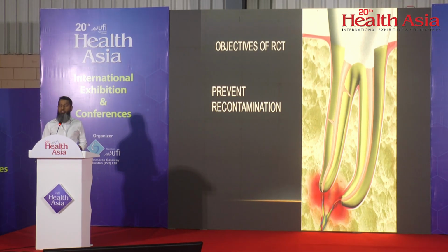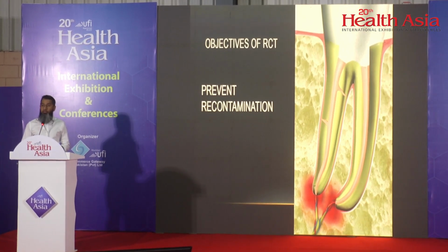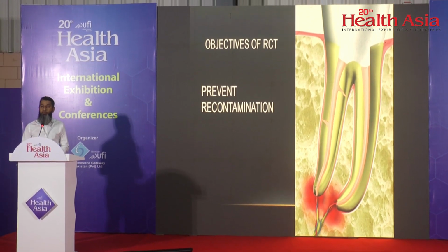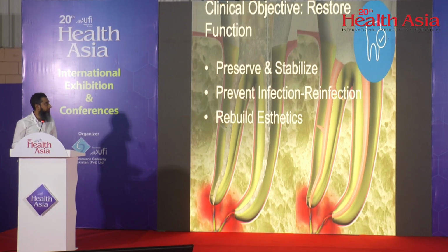And ultimately, once you have cleaned the canal, you need to seal it in the perfect way so that the bacteria cannot re-enter the canal. So first thing is your cleaning and shaping, and the second is your obturation or your sealing of the canal. Both things combined will result in a successful result of root canal treatment.